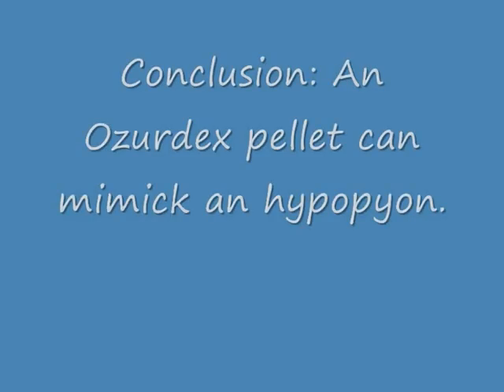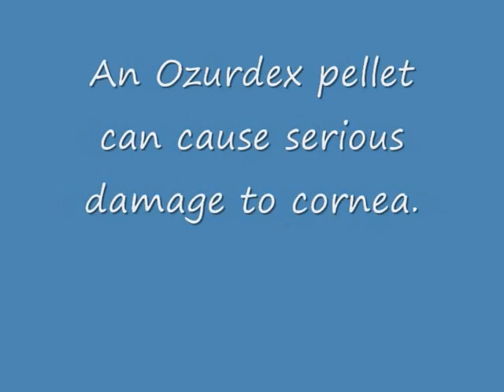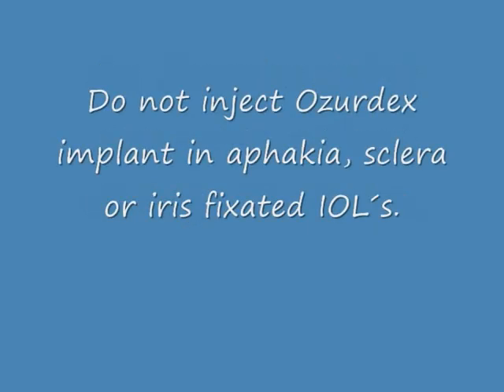And that's the surgery. Conclusion: an Ozurdex pellet can mimic a hypopyon. Ozurdex pellet can cause serious damage to the cornea. Do not inject Ozurdex in aphakia, scleral or iris-fixated IOLs.